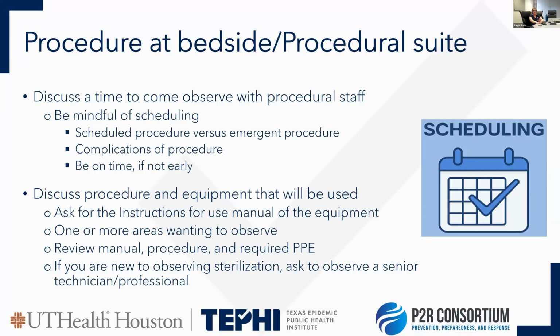Because usually, depending on your facility, this might be run by multiple leaders, same person, depending on how big it is. So anytime you can schedule a time to go in, asking for the MIFUs or the IFUs beforehand, so you know what is being used, how it's being used, what it should be using. This is a good way also to ask appropriate questions during this time, since you have just read the manual, you can quiz the staff, because this is great practice for them too, to make sure that they're ready for when Joint Commission, CMS, or anyone else comes in and audits them.